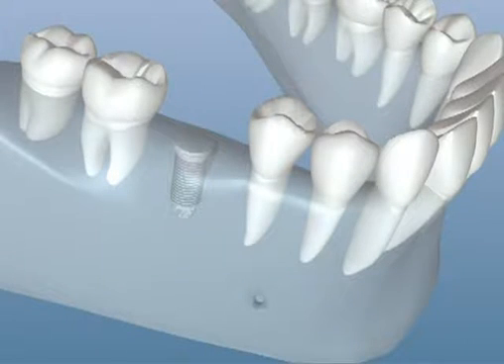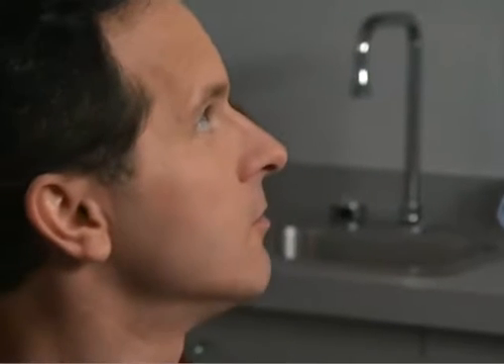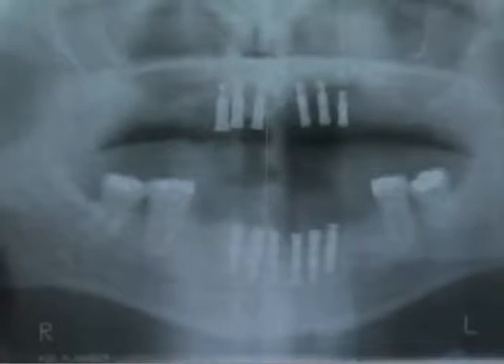And during this time, osseointegration takes place. Now, this is the process where the jawbone grows tightly around the implant to hold it firmly in place. The osseointegration process is verified through clinical examinations and X-ray diagnosis, and this process must be complete before the second phase of the surgery can occur.